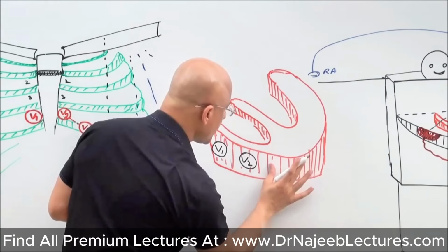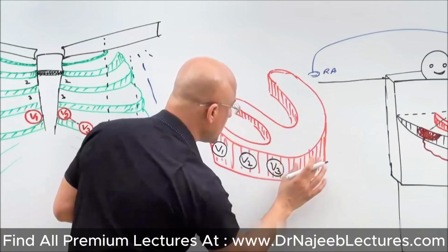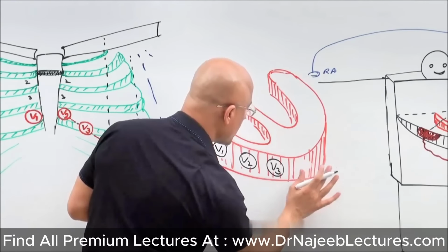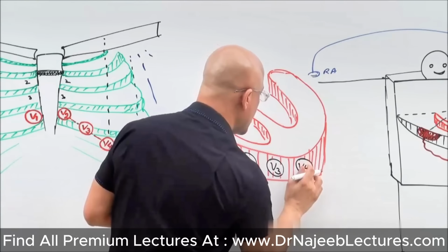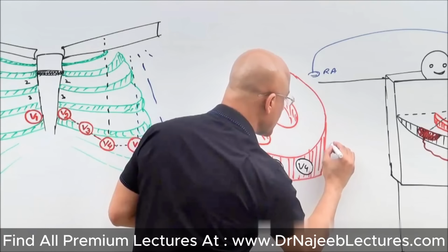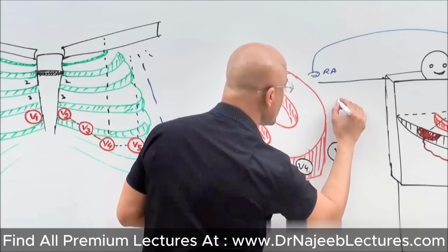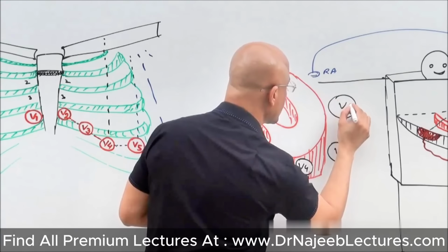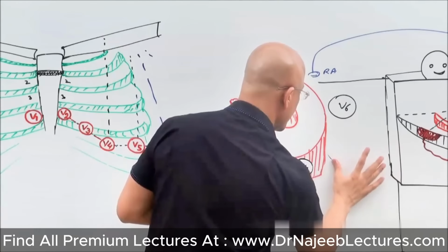Here it is V3 position. Yes, good. Here it will be V4 position. Yes, very good. And here it will be V5. And here it will be V6.